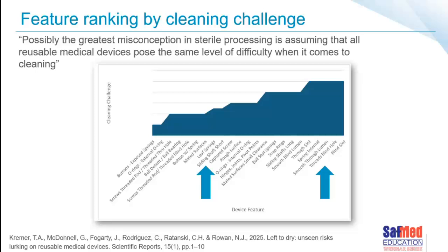So looking at the graph over here, you can see that these particular devices, like mated surfaces and rough surfaces, are quite difficult to clean. But look how really hard it is to clean threads and blind slots. They are exceptionally hard to clean.